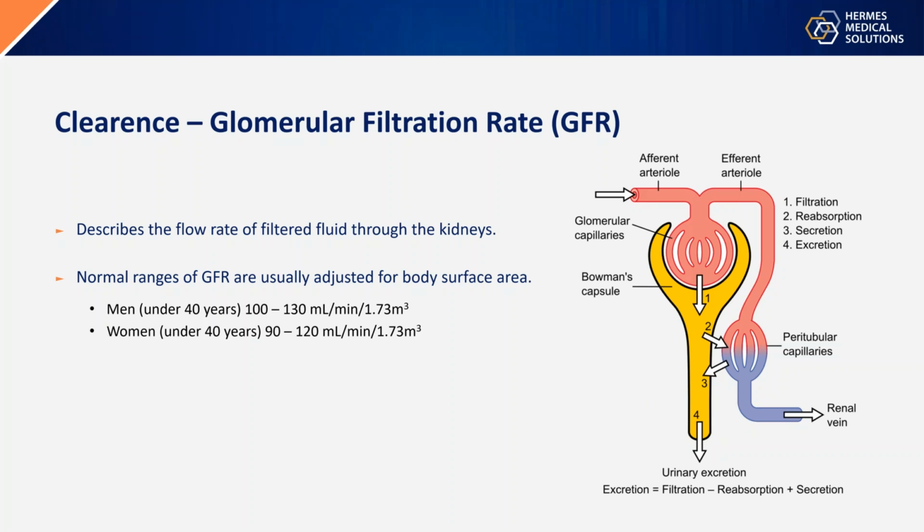The most common reason to do GFR is because the patient will undergo some treatment, most often toxic substances like cytostatica for cancer treatment. And we want to be sure that the kidneys can keep up with the toxins so they don't accumulate in the body, becoming dangerous for the life of the patient. So it can be cleaned.